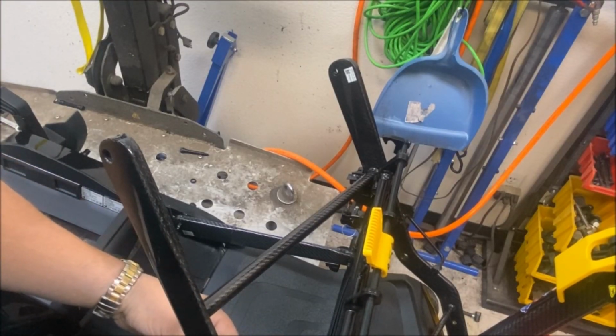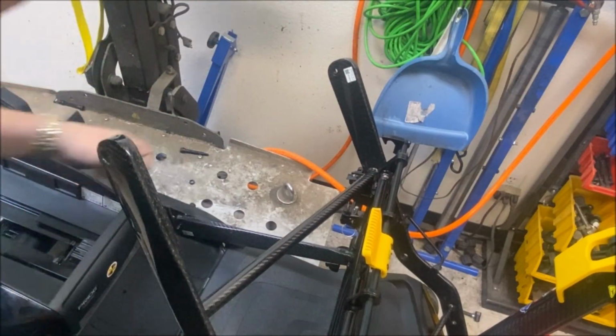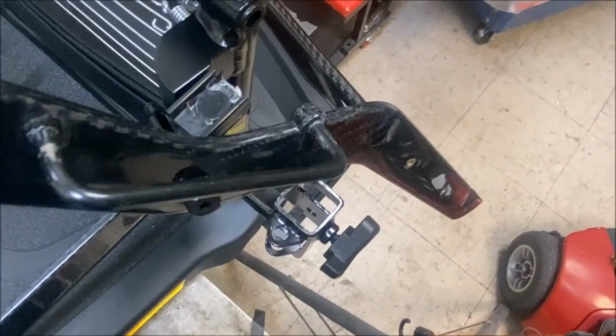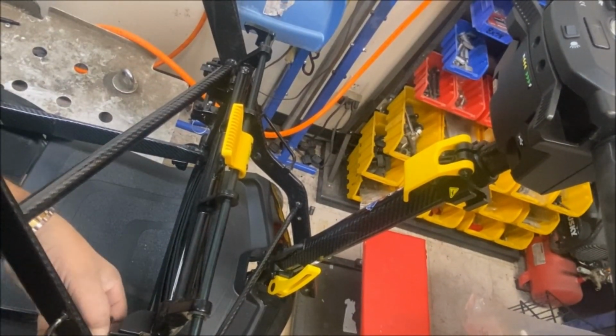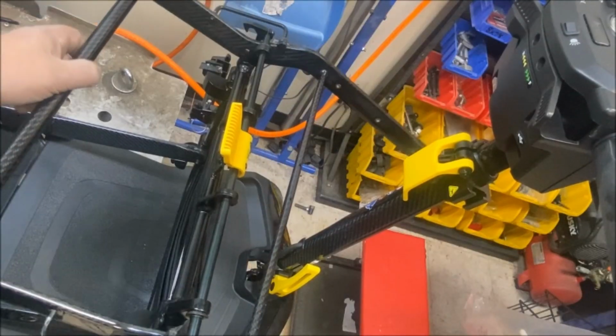There's an insert on the frame. That one stayed on there. So you can see that. So you've got an insert on there and there, and also an insert on this side there and there. So there's inserts on both sides that go through the carbon fibre, and then yeah, washer on the other end, and then the acorn nut. Right. Remove that, and that should get rid of this, hopefully.